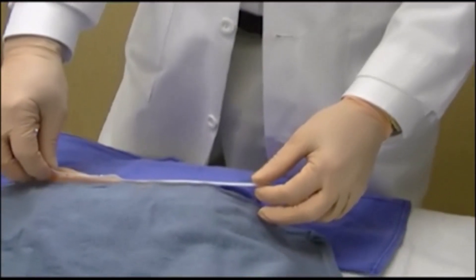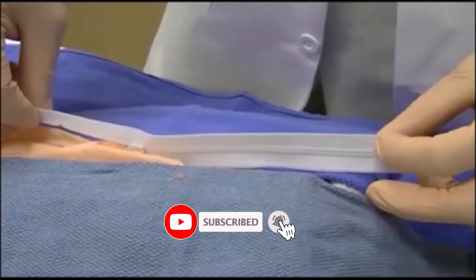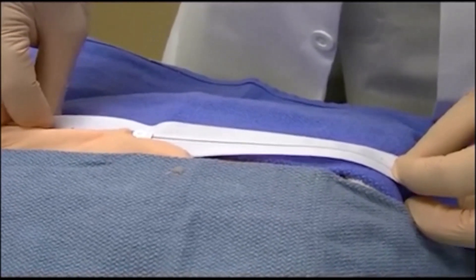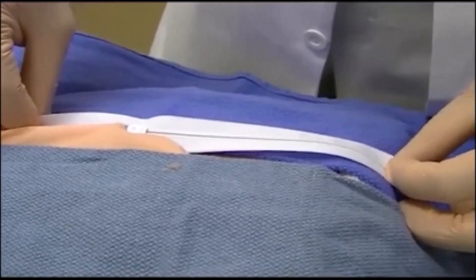To demonstrate a zipper entrapment, we have taken a glove and caught it in a zipper to simulate the thin skin around the penis, which is often the place where a zipper would be caught. This demonstrates the glove caught up into the mechanism of the zipper.